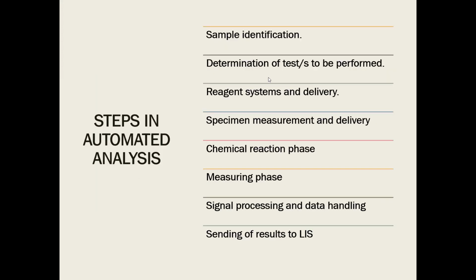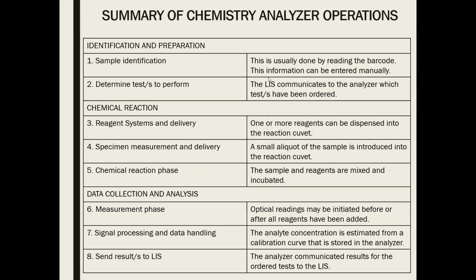Now, what are the steps in analysis or automated analysis? Number one, we are almost done. Sample identification, determination of the test to be performed, reagent system and delivery, no? Specimen measurement and delivery, chemical reaction phase, measuring phase, signal processing and data handling, sending of results to the LIS. O, puntahan po natin ito para po mas madali natin siyang maintindihan.